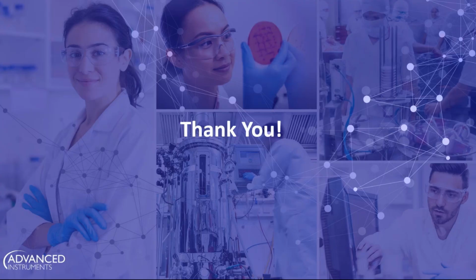Other questions, concerns? Are you just tired of hearing me talk? Great question, Nicole. Nicole asked, can it be connected to LIS? Easily. It's easily integratable with your LIS system. Sorry if we didn't cover that. Yes, totally. We made this for ease of use. We wanted to make sure that everything you would do in your normal function automatically fits in with the GloCyte and its workflow.